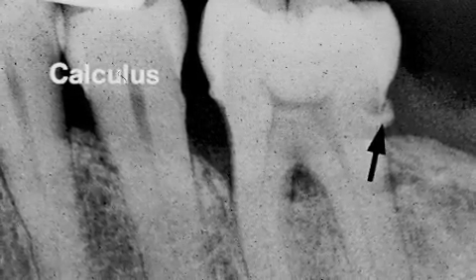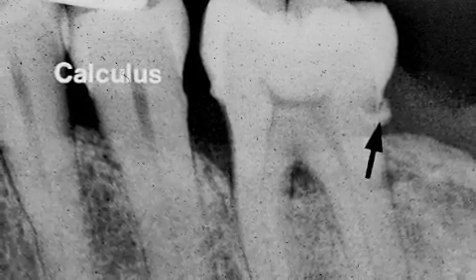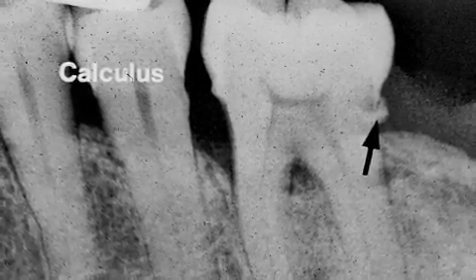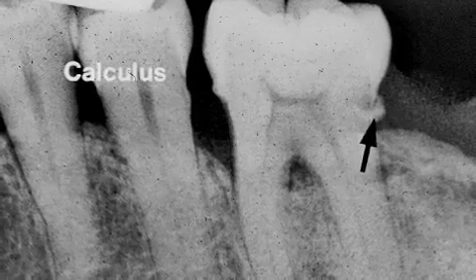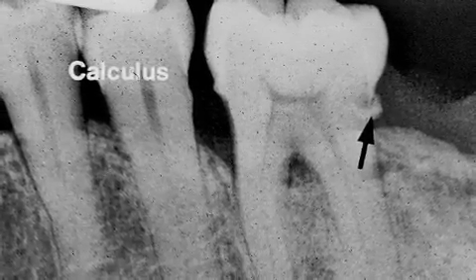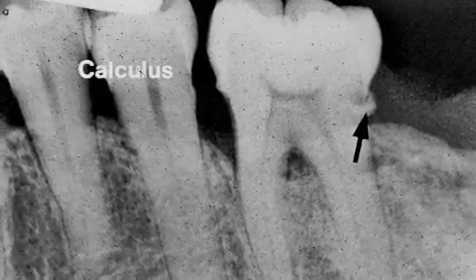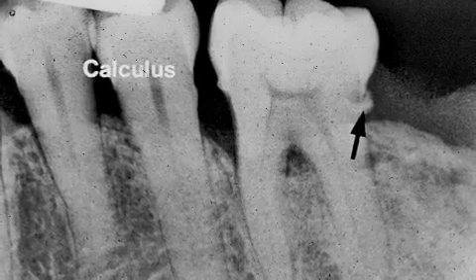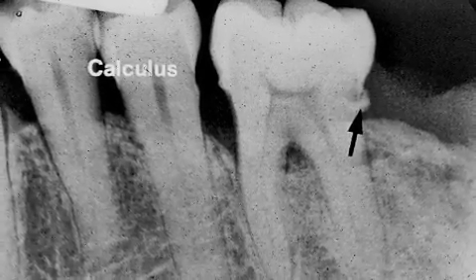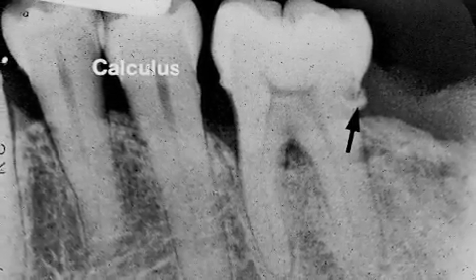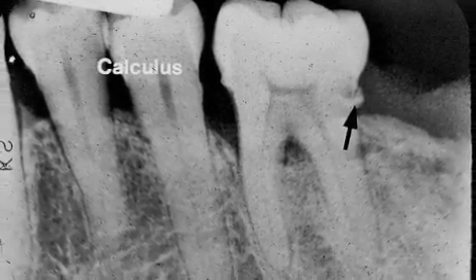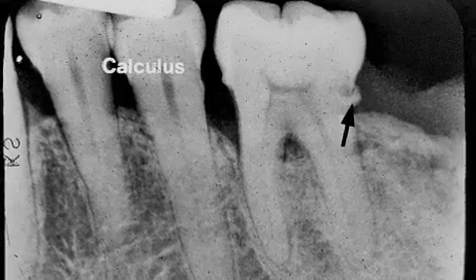Here we see calculus. It appears radiopaque on the x-ray. Can you find other areas of calculus? The density of calculus determines whether it is seen on an x-ray, as well as the angle.